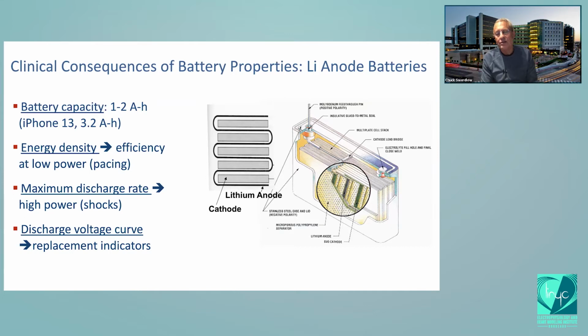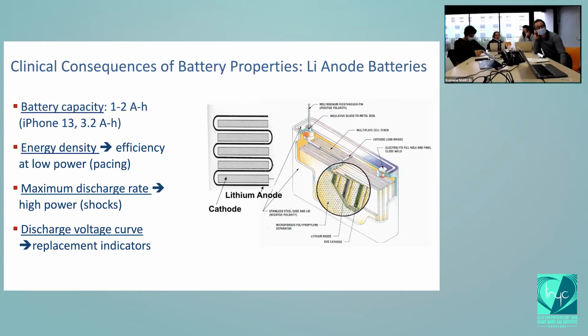There are a couple of possibilities. One is the battery itself. The other possibility is always that there's some other electrical component the battery is attached to that shorts and is pulling continuous current out of it. I apologize, but I don't recall what the failure mode was in SICD. There's the same recall on some Biotronik ICDs and also some Abbott pacemakers.